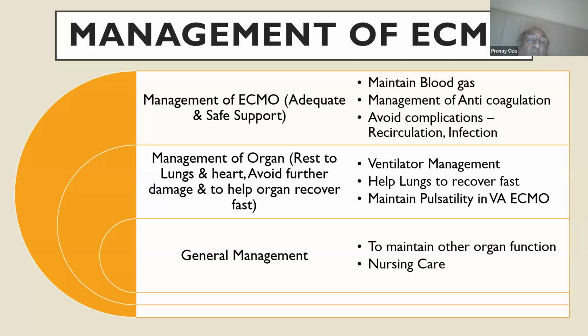So the management of ECMO, basically, I divide into three parts. One is the management of ECMO per se for an adequate and safe support, and that is what I discussed. Maintain the blood gas, maintain anticoagulation, avoid any complications for VV as well as VA ECMO.